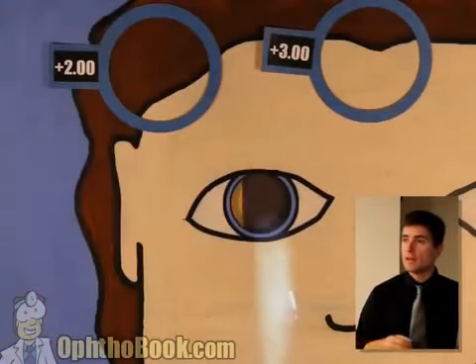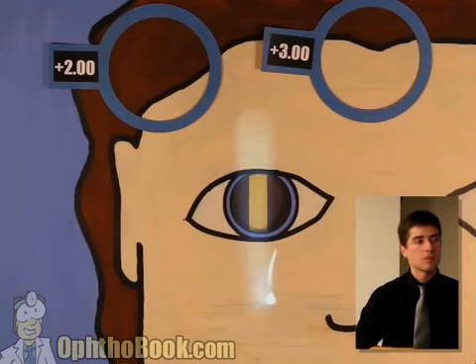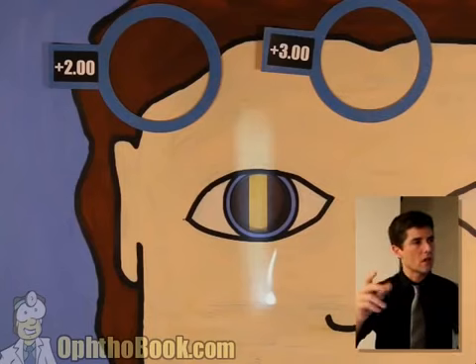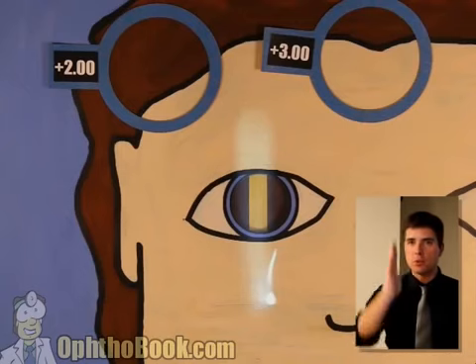Now, don't try to do the math in your head while you're doing this. Here is how I calculate the prescription based off this. The sphere is +2. The cylinder power is the difference between them, so it's a +2 +1. It's just like using a lensometer, right? You start at one number, and the amount you shift it is your cylinder power. Same thing with this. So this is a +2 +1, and the axis is at 90. And we know it's at 90 because our light beam is going up and down.